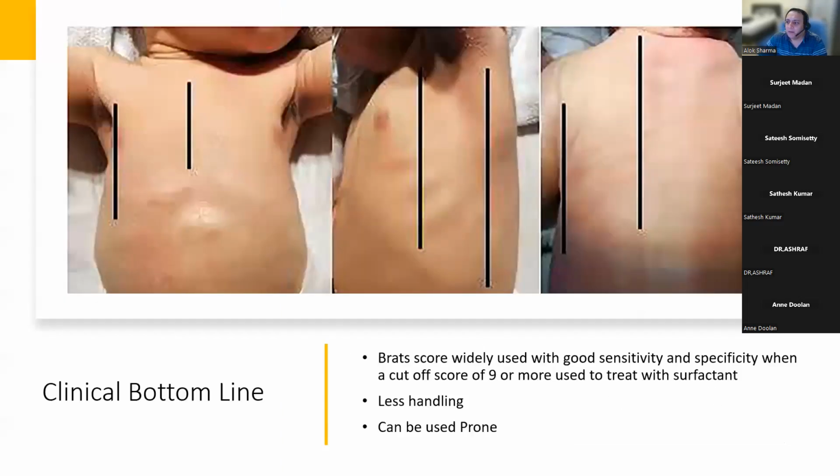I think what is very important from our perspective is using a standard score. Now, a few things. Where does this cutoff of 9 come from? Anybody? Anybody done a little bit of reading of the chapters? If you're using Brat's method?